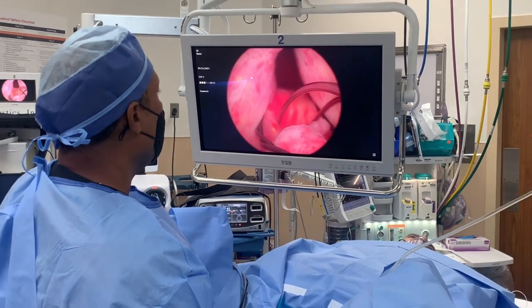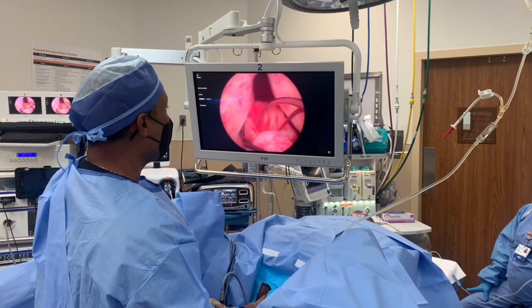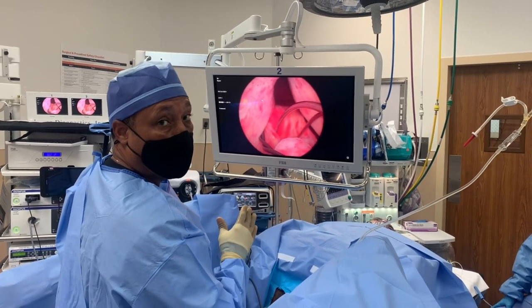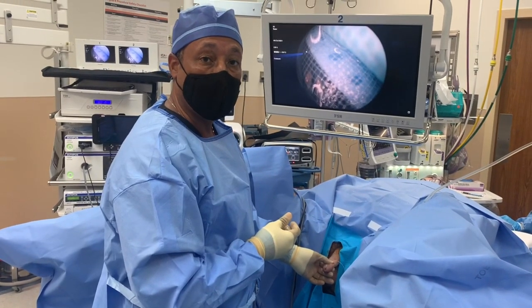So this is where we're going to leave this now. This will expand over the next seven days and then leave us with almost like a mechanical TUIP to give us this kind of permanent opening and reconfiguration of the bladder neck and its prostatic channel. Dr. Hallowell, Z-Urology, Fort Lauderdale.